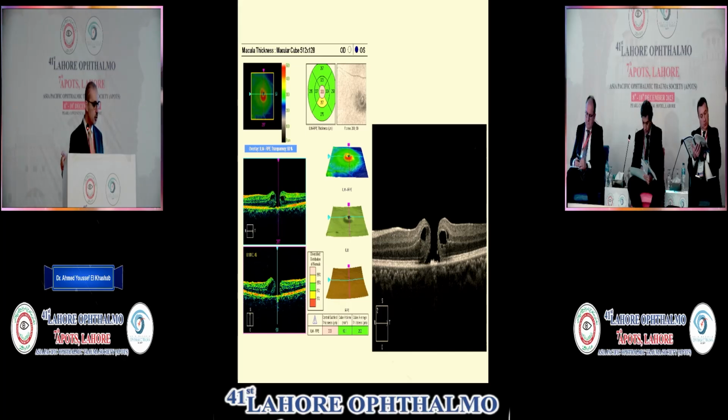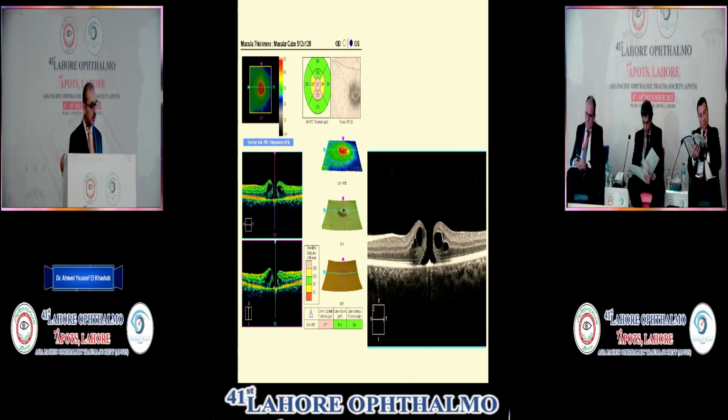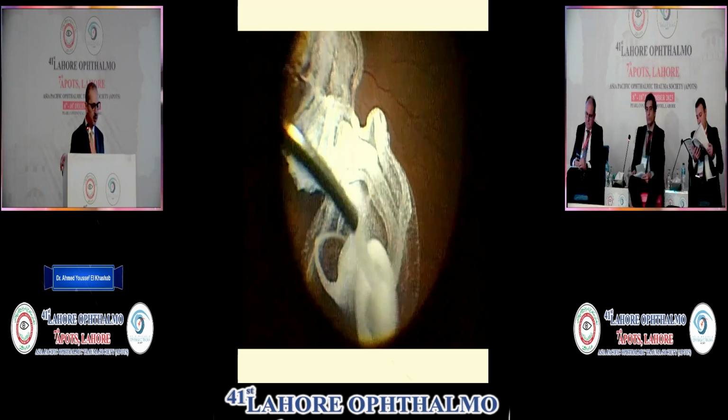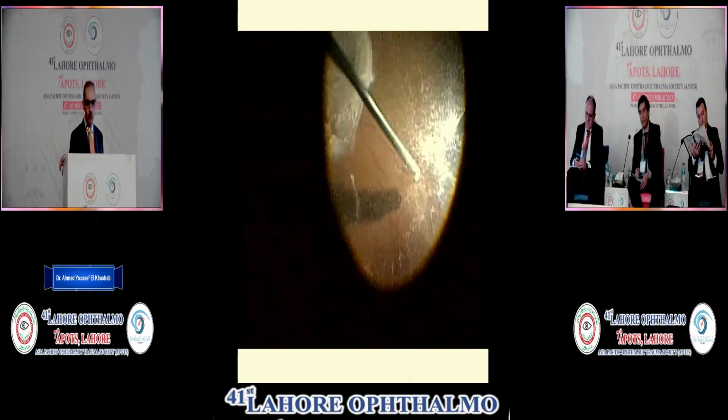This is a patient with a laser burn. I was initially thinking that this hole would close, but following up the patient, waiting for closure of the macular hole, I saw that the hole was increasing. It was not closing. So that's the time that I intervened. And again, only ILM peel would be more than enough.